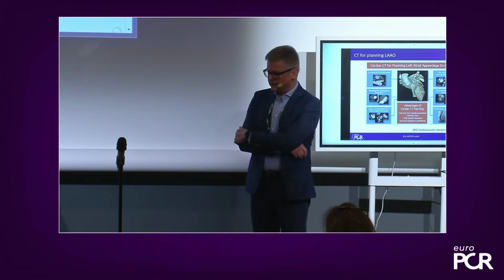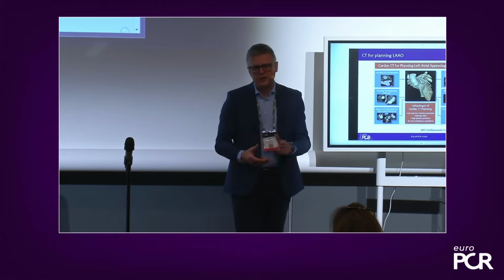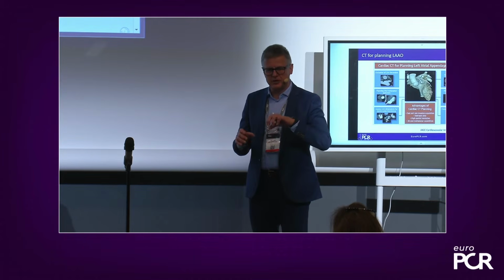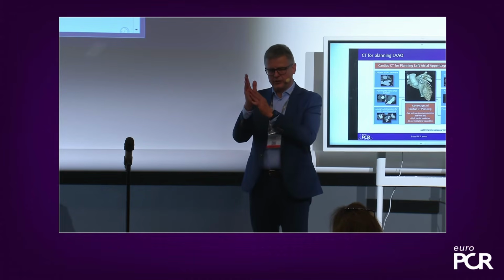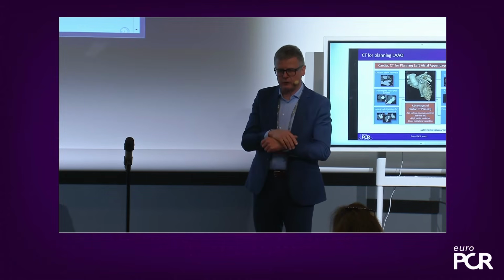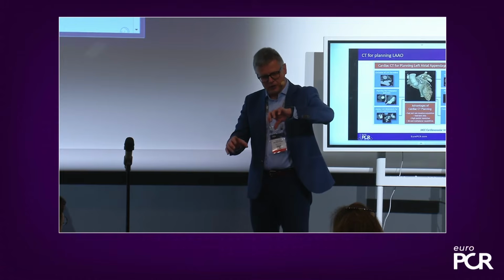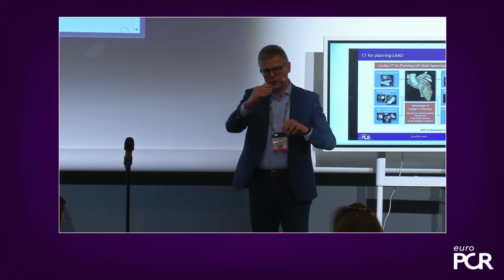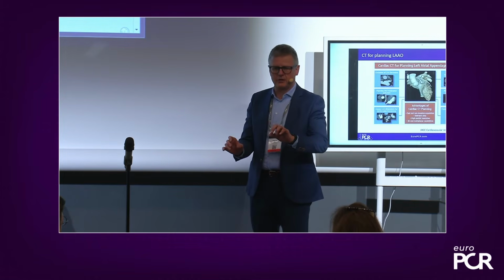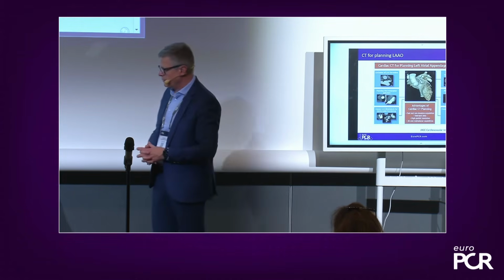Yeah, I agree, and it's something that people struggle with, but it's very easy to do. You just come with your ICE probe to the right atrium without any rotation of the tip. Then you seek the home view and you posterior flex the tip of the catheter a little bit so you have a good superior, inferior view of the septum. The septal view is very easy to get. From there, if you rotate clockwise, you will look upon the posterior part of the septum, and if you rotate counterclockwise on the shaft of the ICE catheter, you will look towards the aorta, towards the anterior part. So that's the way we do it.